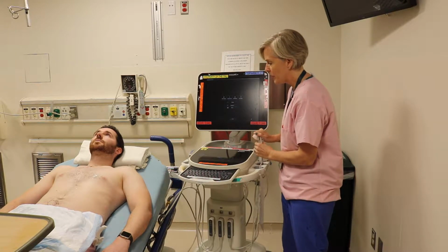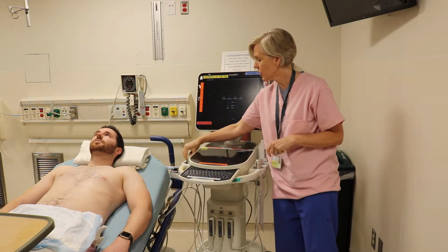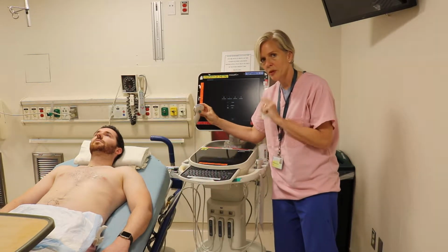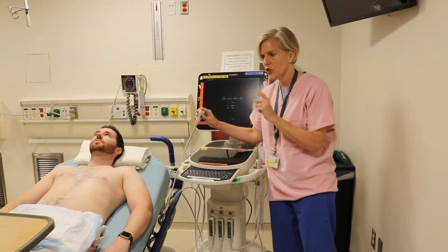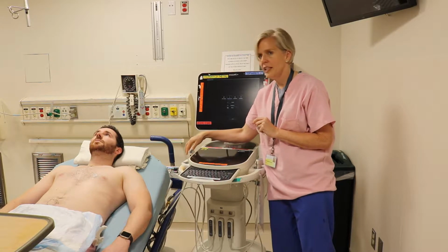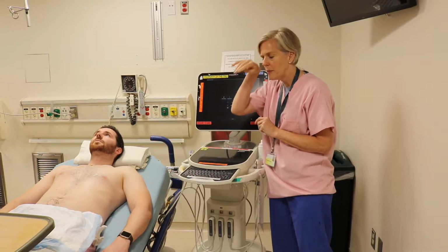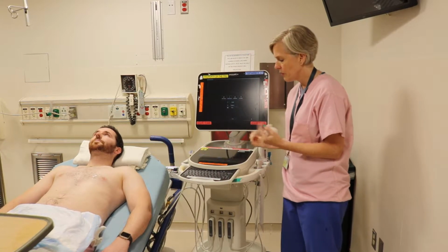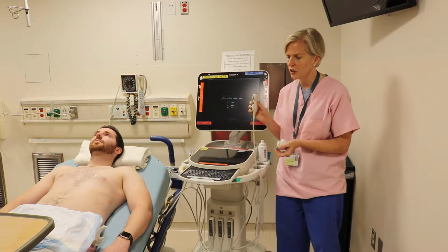For the abdominal imaging that we're doing today, you want to use either the curvilinear probe, if you like a bigger window and you're not imaging the chest so much, or the phased array. This lets you image the chest a little bit better because it gets into the rib spaces. They basically give you the same depth of imaging, so both of them are good for abdominal imaging and deep chest imaging. If you want to image more superficially for pneumothorax, you're going to use this, and for the IJ, you're going to use the linear probe.